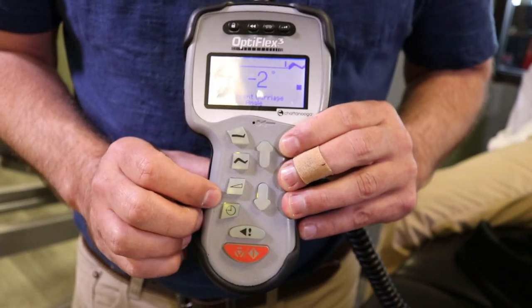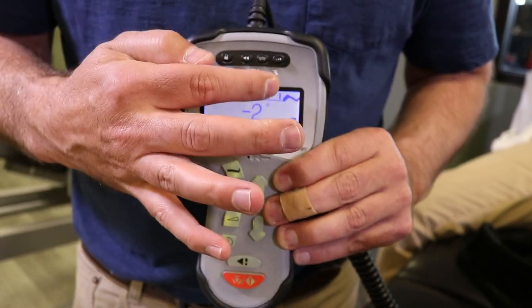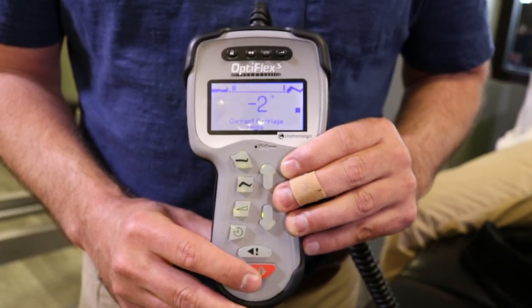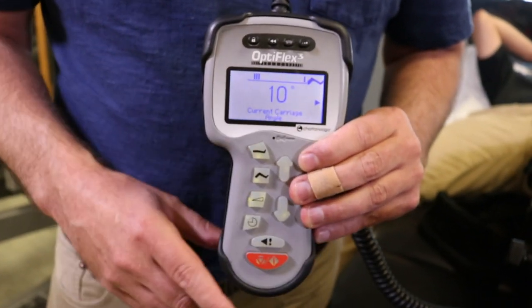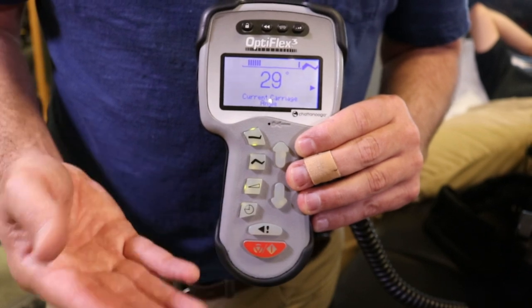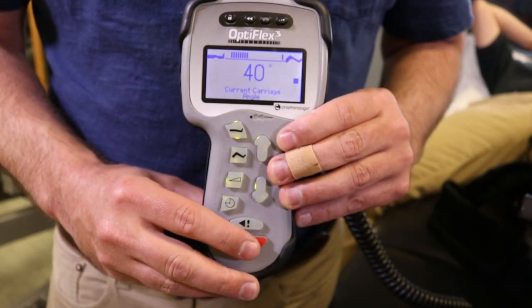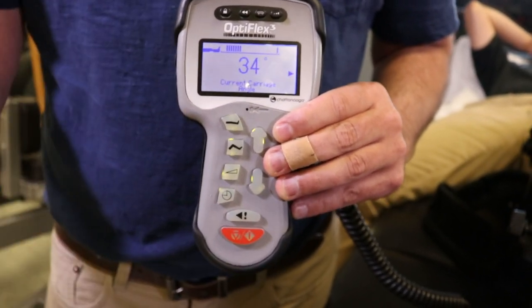There's a little exclamation triangle button that's deactivated — that's for in-hospital use only. The extended feature buttons are for the clinician; the patient does not need to worry about those. The red button is both the stop and the start. When the patient hits start the machine will go and show the current angle in real time. If the increase in angle is causing any discomfort, the patient can hit the stop button — it'll immediately pause, stop right where it's at, then start again in the reverse direction and go back down. It won't continue upward when restarted.